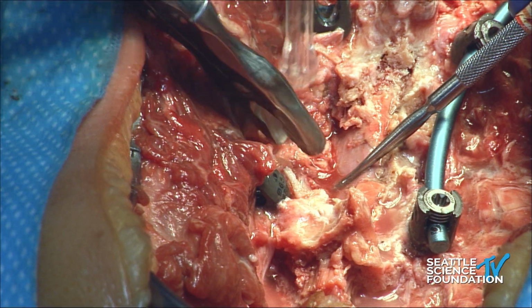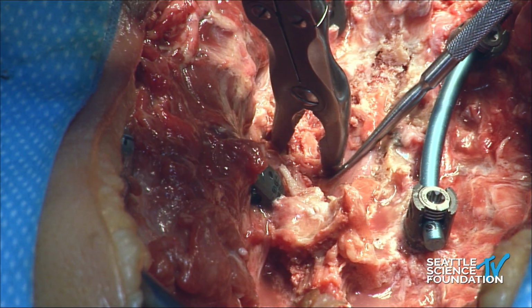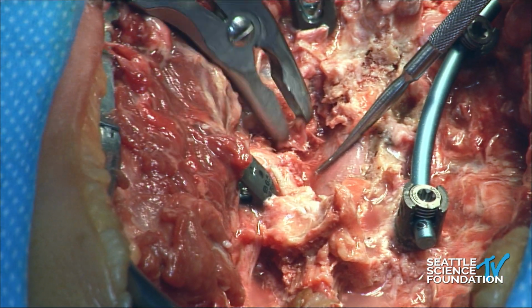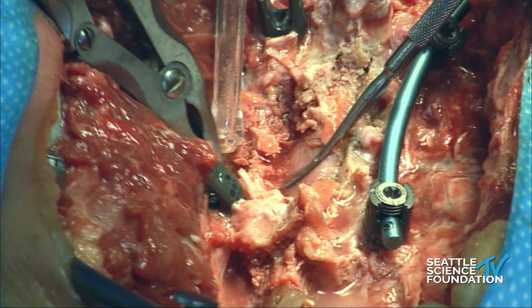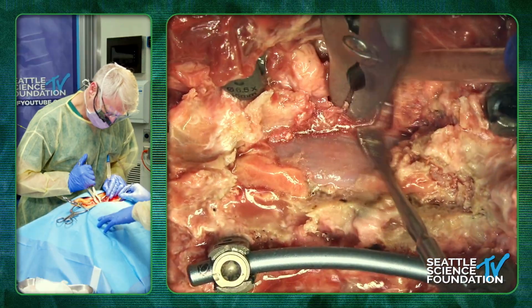Okay, so what we've done now, so I'm going to take the top of the pedicle off. Is this an ultrasound? No, it's just a regular one. Okay, so he's going to separate the nerve.